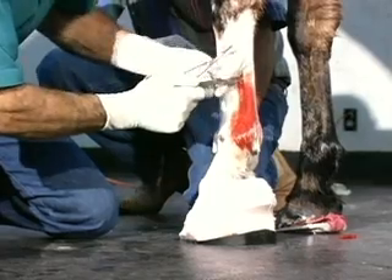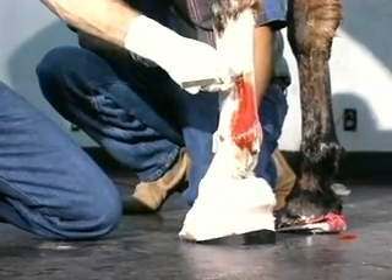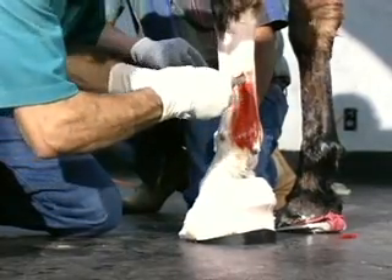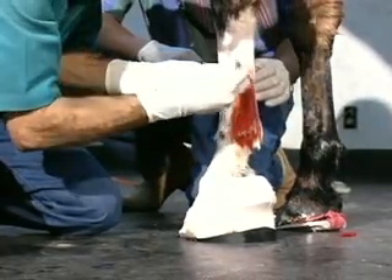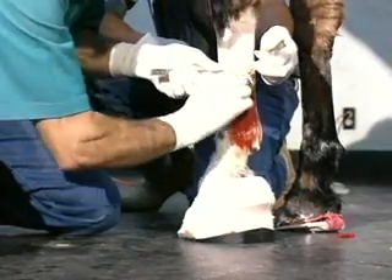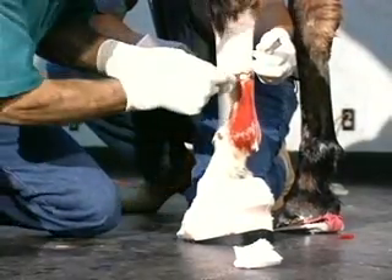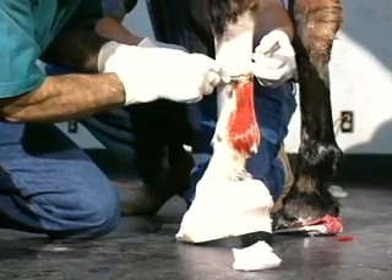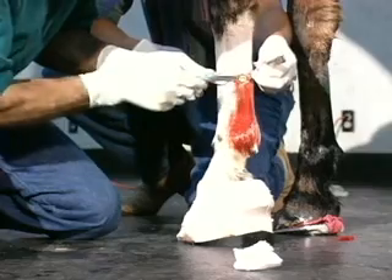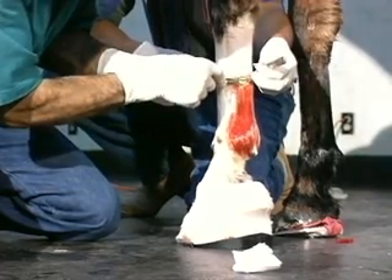Slide the one with the heavy curve to the inside. Take the other one, which has a little less radius, and go between the superficial and the deep. Without that wedge on, you could not get these retractors between those two because the deep would be very tight. Notice how my assistant's hand is actually raised up a bit too high — I'm going to have to bring it back down. If you allow that hand to go too high, you'll slip off and can cut the vessels behind. So keep them in line — they're hooked together.